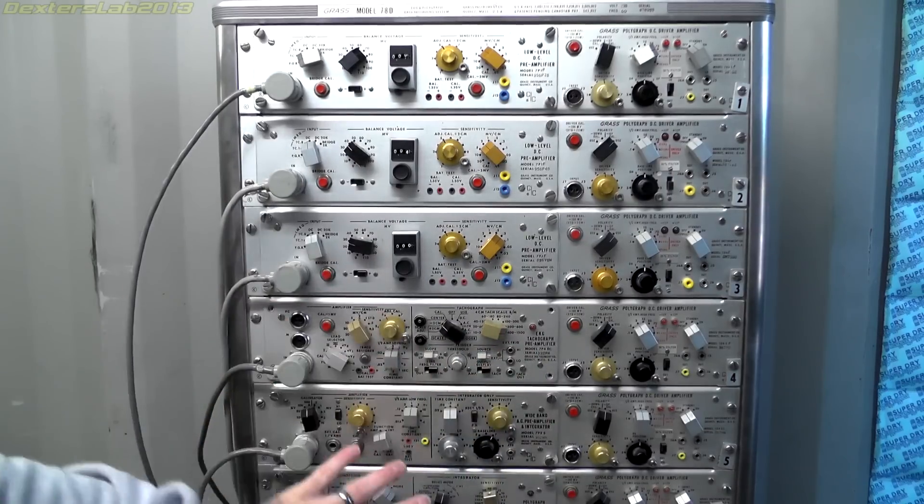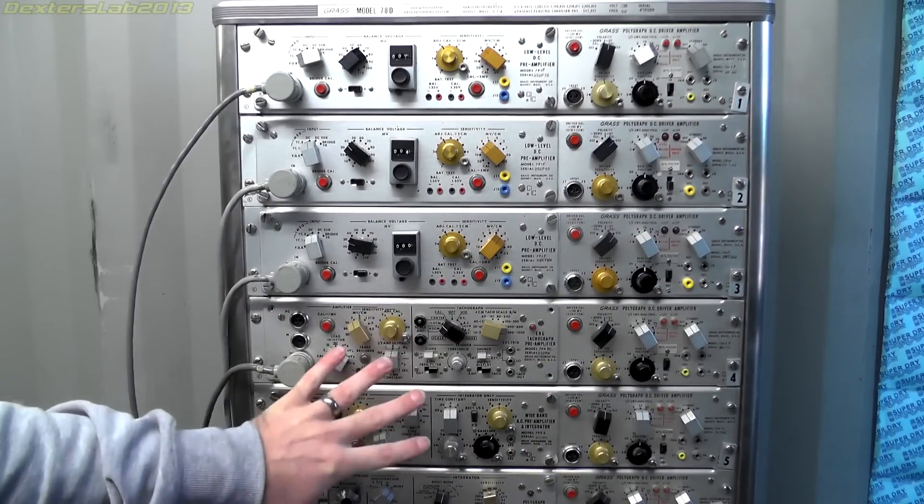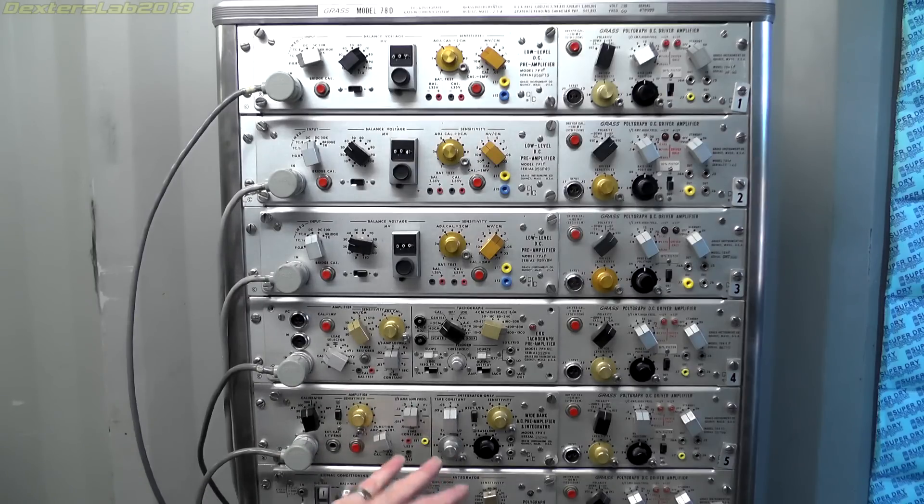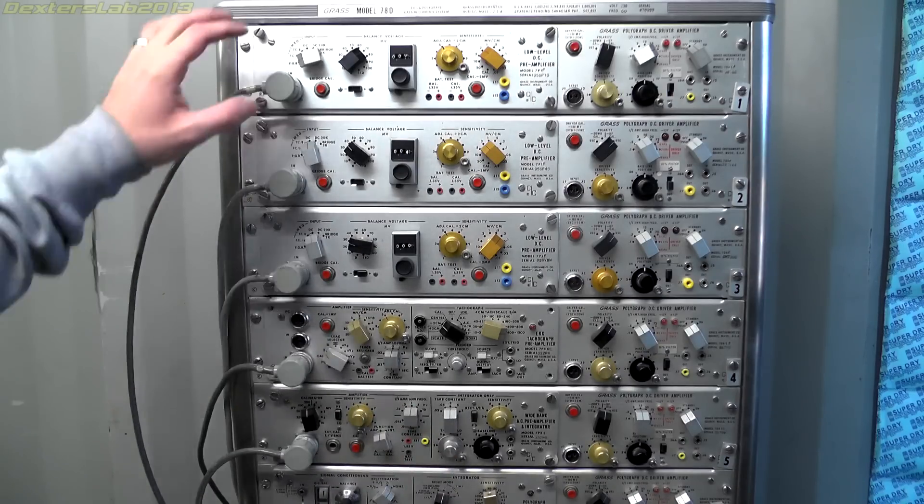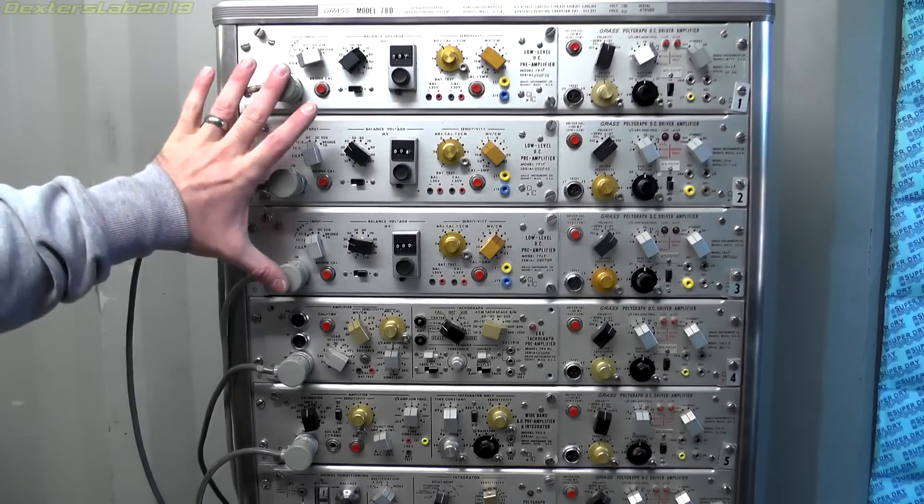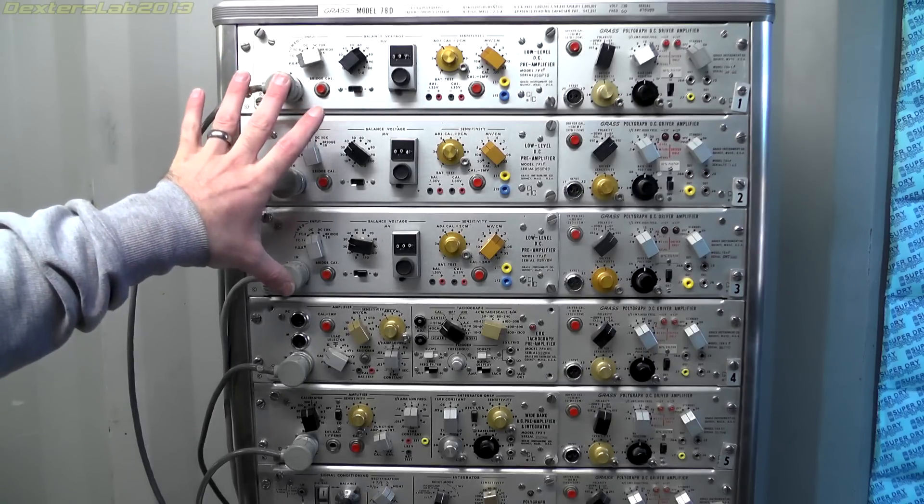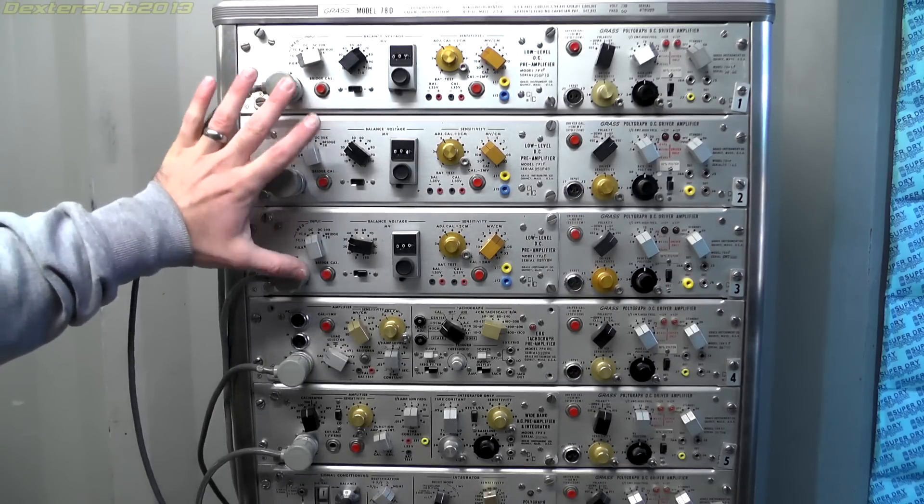Like for example here we've got an EKG tachograph preamp. Now if you didn't need that and you wanted some other kind of amplifier you can just take this out and swap it with whichever module you actually need to use. So the input modules are obviously set up so each one has its own specific set of controls to do whatever it's designed to do. These three modules here are low level DC preamps. I think these are fairly generic.